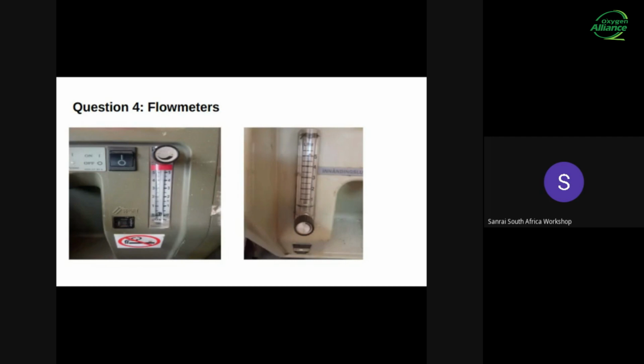Most flow meters are designed for a different concentrator model, even with the same flow rate, such as the Airsep flow meter and the DeVilbiss 525 flow meter that you have. These are not interchangeable with each other, mainly because of the difference in positioning of the inlet and the outlet port and the differences in the pressure at which they were calibrated. However, flow meters designed for a different concentrator model, but with the same flow rate, are interchangeable only when indicated to have been calibrated at the same pressure and have the same footprint.